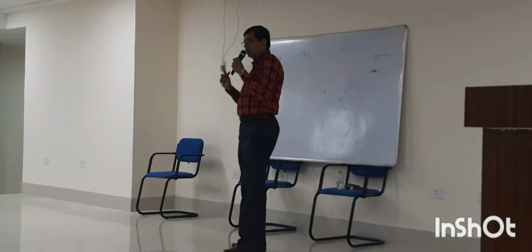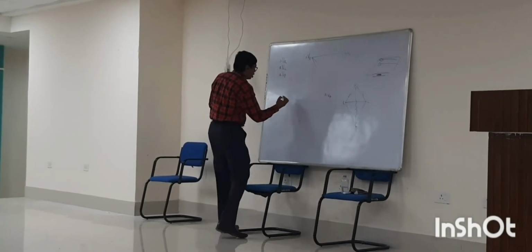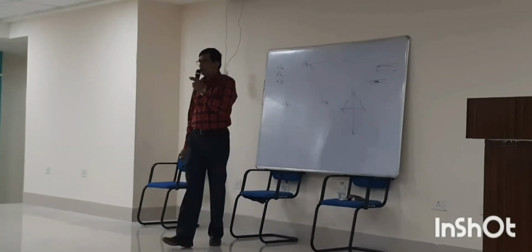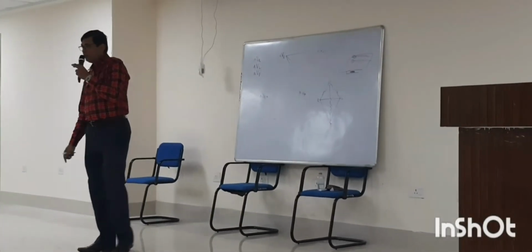Now, how is it augmented? Suppose I am considering aVR. For augmentation, the resistance of the particular limb is detached from the common terminal.